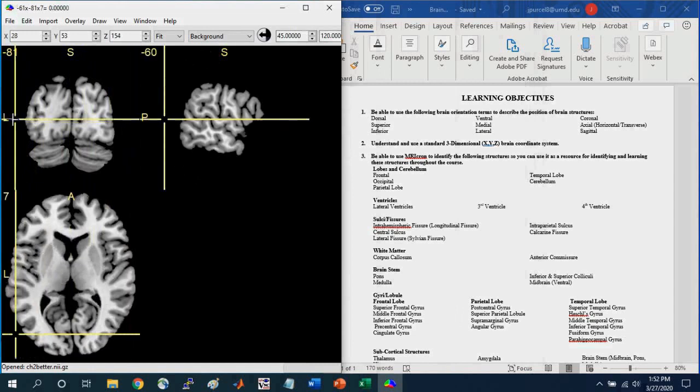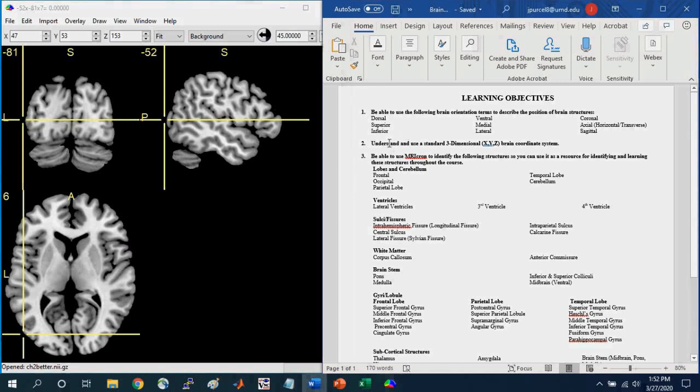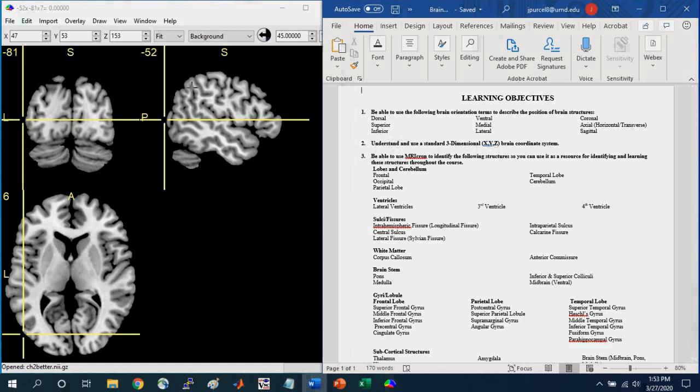Next, it's important to understand the XYZ coordinate system. So you may have noticed these numbers up here. These refer to the XYZ coordinates in standard brain space.